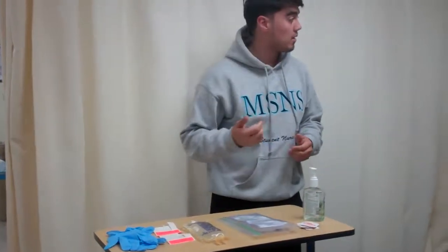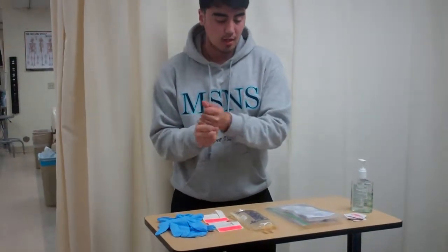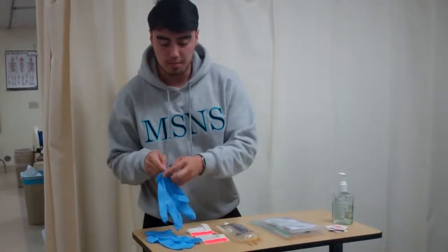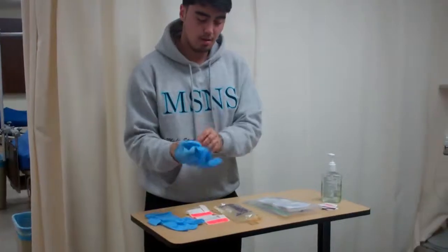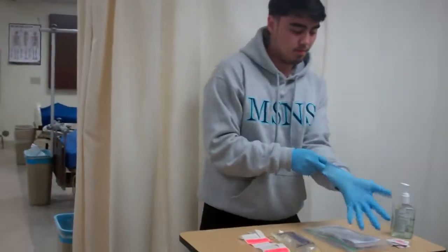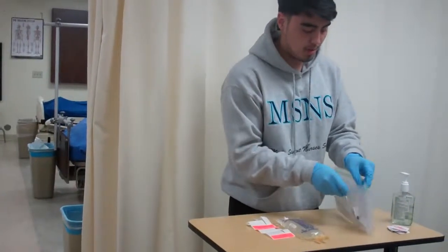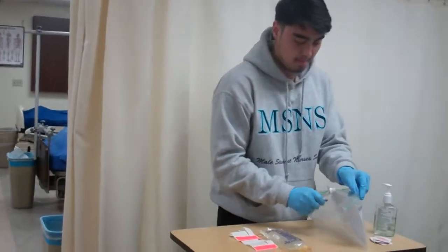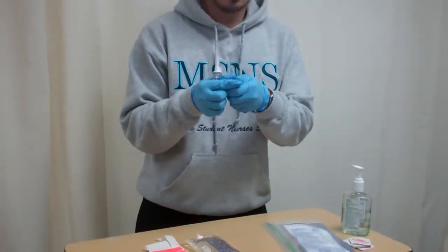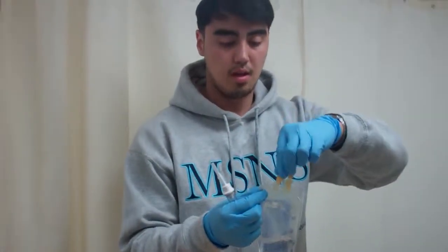So I'm going to go ahead and begin and just do the hand hygiene. We've checked all of our patient rights to ensure that we have the proper medication, the dose, the route, the time also. What we're going to do is go ahead and open our secondary tubing. Perfect. Now that we've opened our secondary tubing, what we want to do is get our medication. And using medical asepsis, what you want to do is go ahead and open the medication bag.